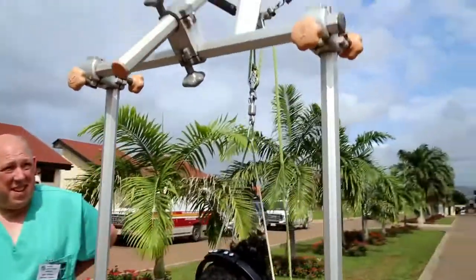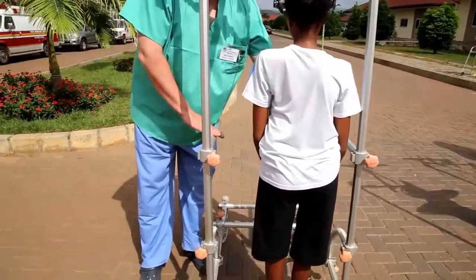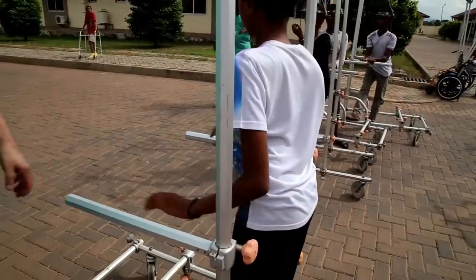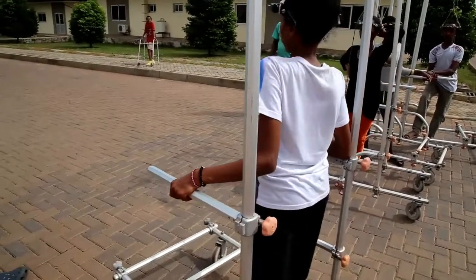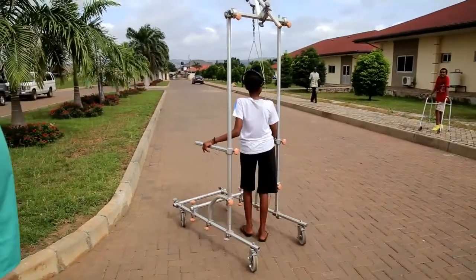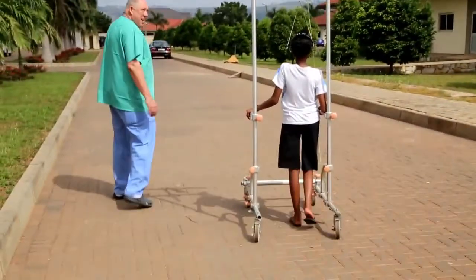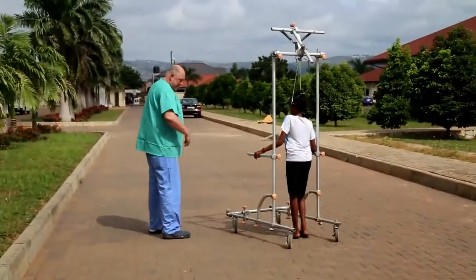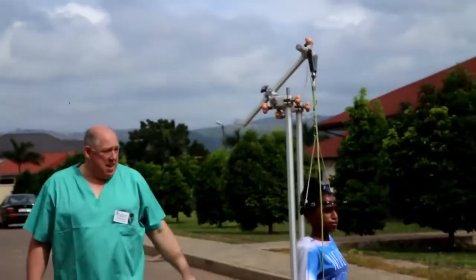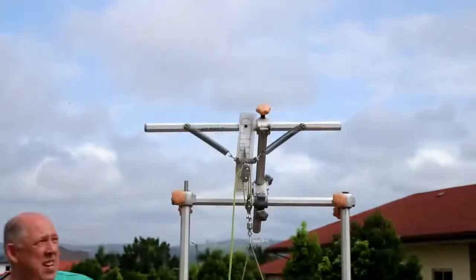The patient can hold the crossbars at the front, and additional bars are positioned for easier grip while walking. As the unit moves forward, she can grab the bars there. When she walks, you'll notice the traction marker is constantly moving — it doesn't stay in one static position, which is expected with a spring-loaded system.